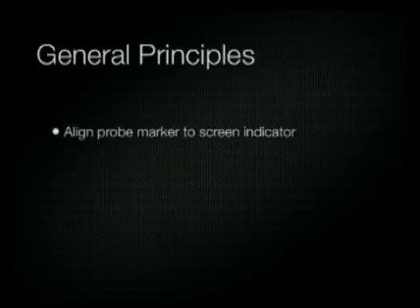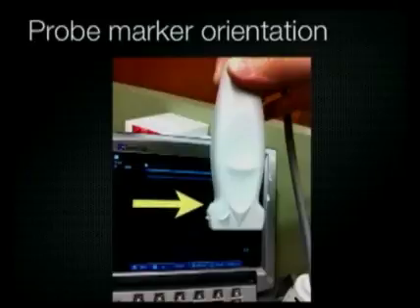Before you cannulate the vein, make sure you align the transducer marker to the screen indicator. This is a crucial step because if you don't align the probe marker with the screen indicator, your left and right will be reversed — this can get confusing when moving the needle. If you forget to do this after you and the probe are sterile, simply tap on the left side of the transducer and see if it corresponds to tapping on the left side of the screen.